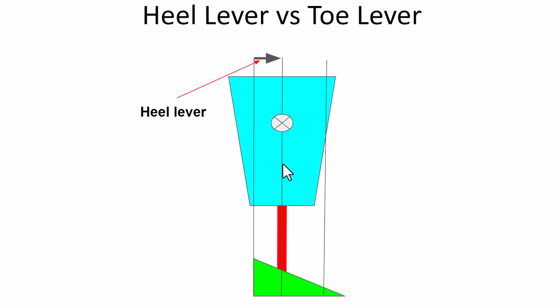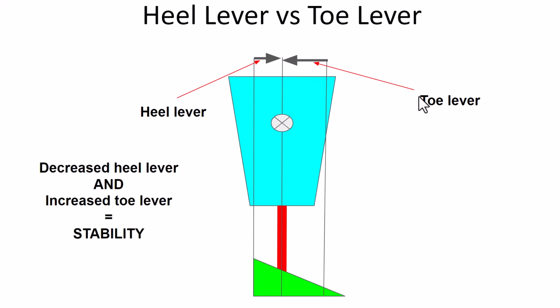Also, if you can imagine, for a prosthetic foot, you have the keel that comes down not all the way to the front of the toes, but almost to the front of the toes. This is the point where terminal stance would happen. So if you have a ground reaction force coming up here at terminal stance, the distance between this force and the center of the socket is known as your toe lever. Most important thing to remember for the rest of the talk.